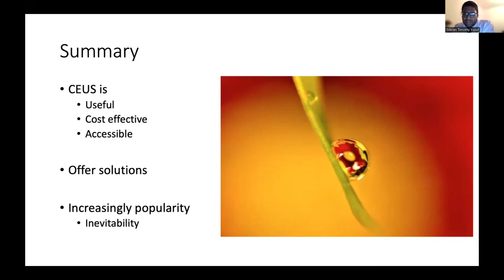It offers solutions, and what I want you to appreciate from that picture maybe is that it reframes how you see things. It isn't ultrasound can only do this, ultrasound can only do that. It's ultrasound gives you a possibility. It gives you a chance to be able to diagnose someone before they leave the department, to be helpful in stratifying who needs to go further.